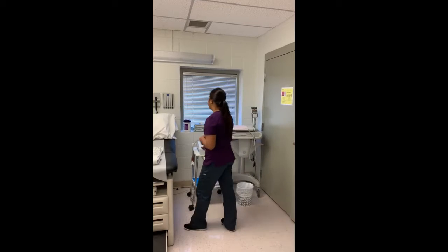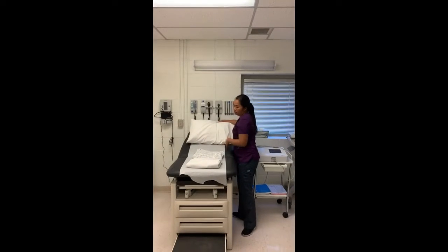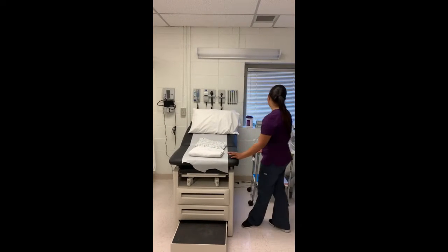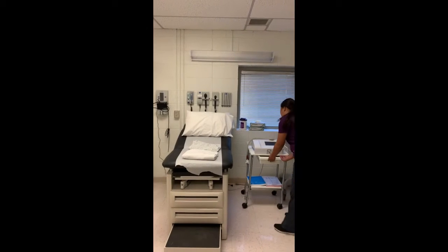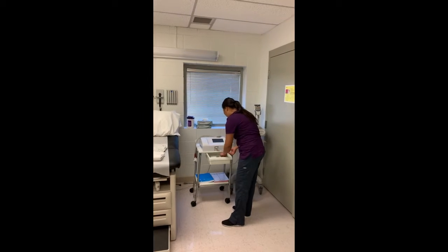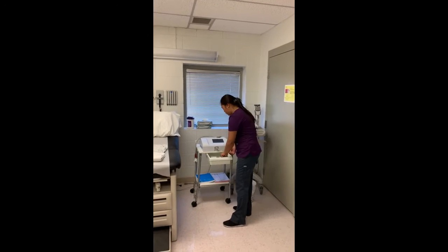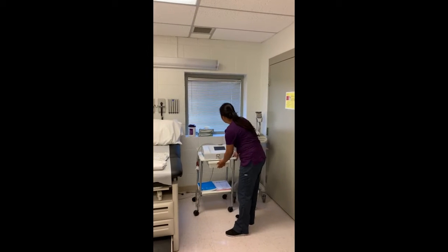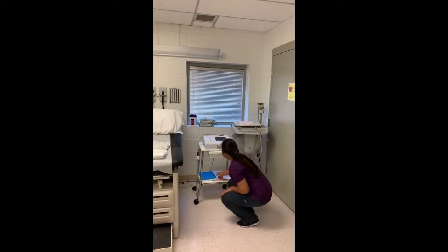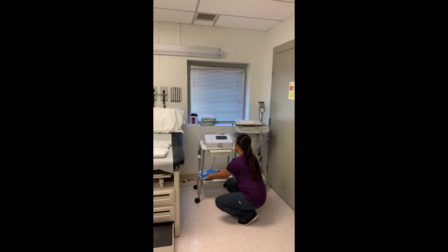So before that, I'm going to obtain the supplies that I'm going to need to do the procedure. I will need the pillows, the gown, the cover sheets, the paper sheets for the exam table. I'm going to check the cart to see if I have electrodes and extras, alcohol swabs, the razor, also the gloves and the wipes for disinfectant, and I'm going to see if they have a manual and extra paper.